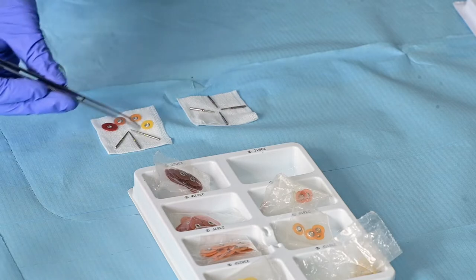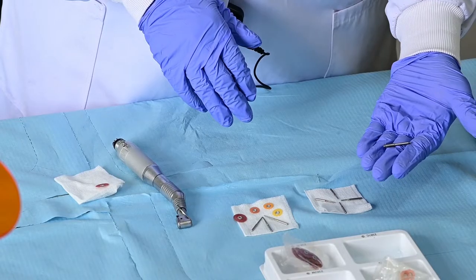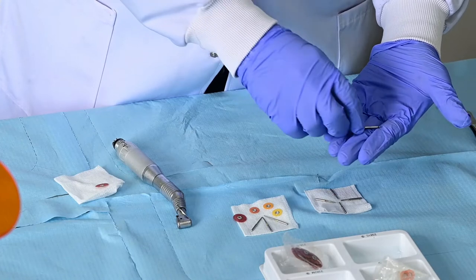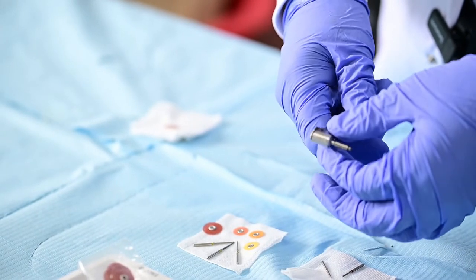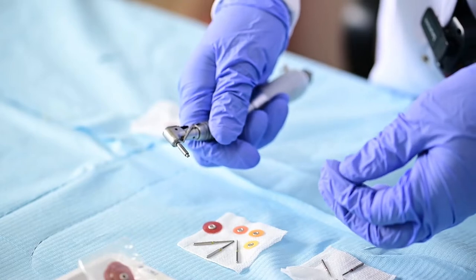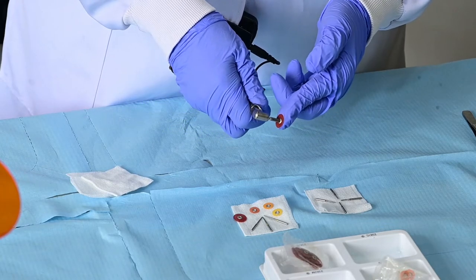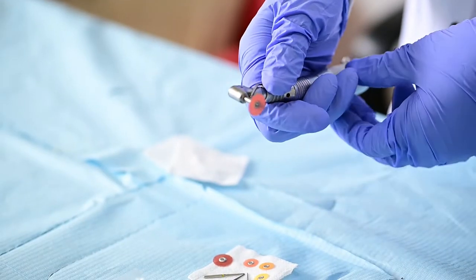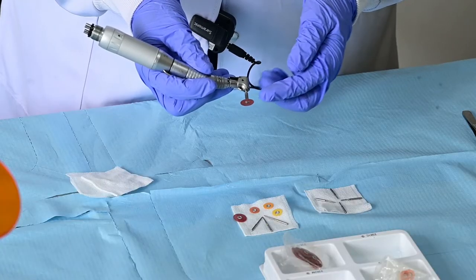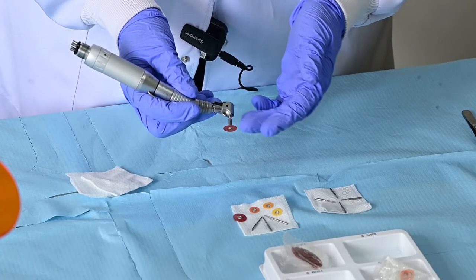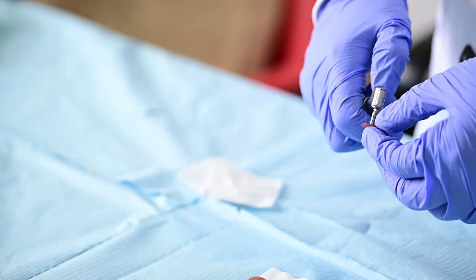So you go for the red and also the yellow to remove excess material. And once you are done with that on a high speed, then you can use the Sof-Lex discs or the Arkansas stones. Sof-Lex discs, you need to have a mandrel which you attach to the slow speed handpiece like any other slow speed bur. And then you now attach the Sof-Lex discs starting with the coarsest. And then from there you are able to polish the restoration without water. You don't need water for this one. And then progressively move from the coarse one to the less coarse, smooth to the smoothest. And by the end of it all you will have a very nice smooth surface of the restoration.